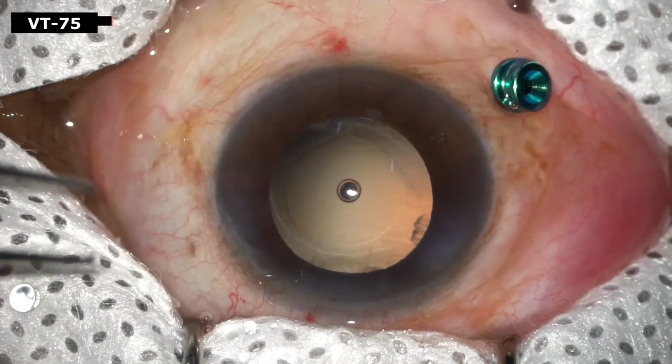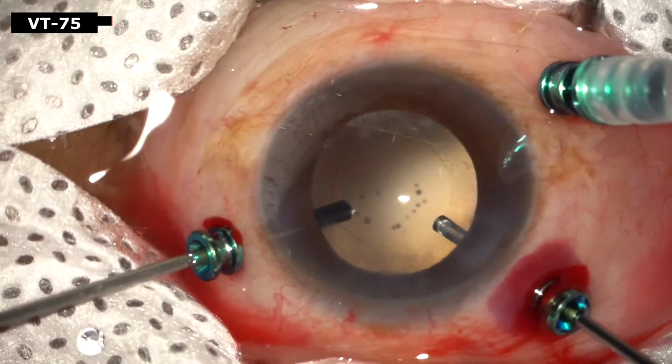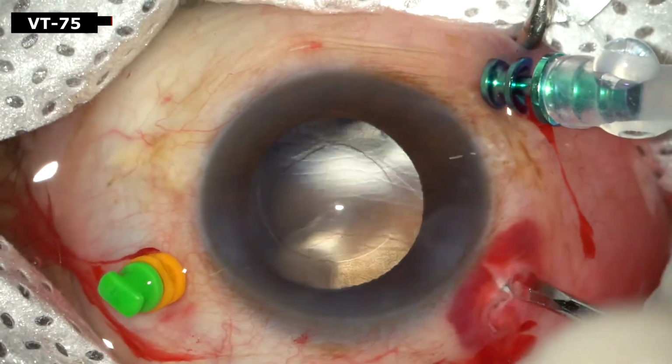Similar steps were performed for the other case. In this case, triamcinolone acetate was used to stain the vitreous. Now again the same phaco tip was used to emulsify the nucleus in the vitreous cavity.